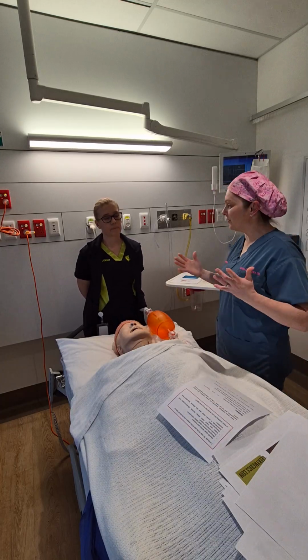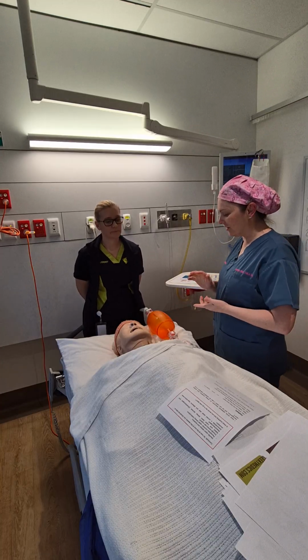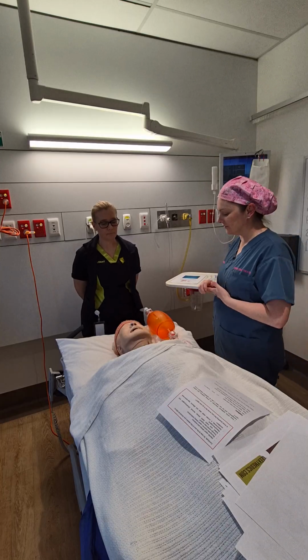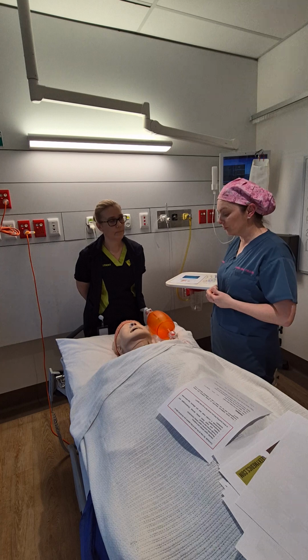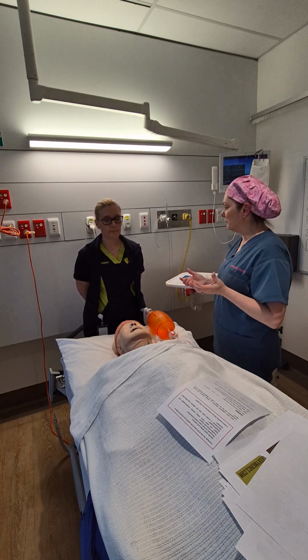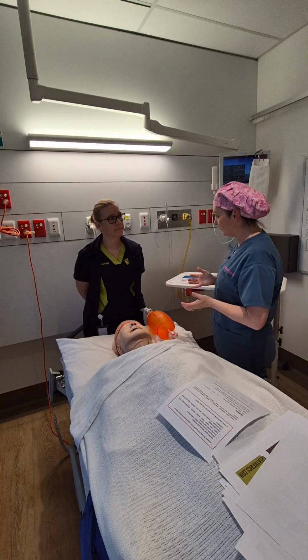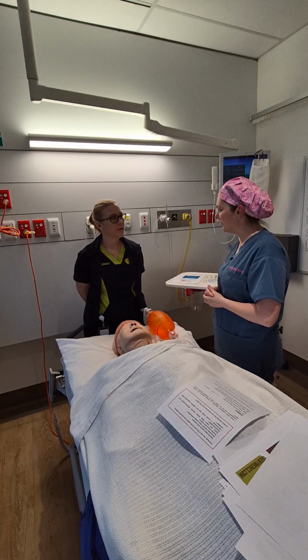Alright, so that concludes the end of our session. Thank you very much. So we've gone through the airway anatomy. We've also identified some common airway obstructions. We've practiced jaw support and provided adequate jaw support. We've gone through selecting, measuring for and inserting nasopharyngeals and oropharyngeals, and we've gone through bag mask ventilation. So well done. Thank you, Sarah.